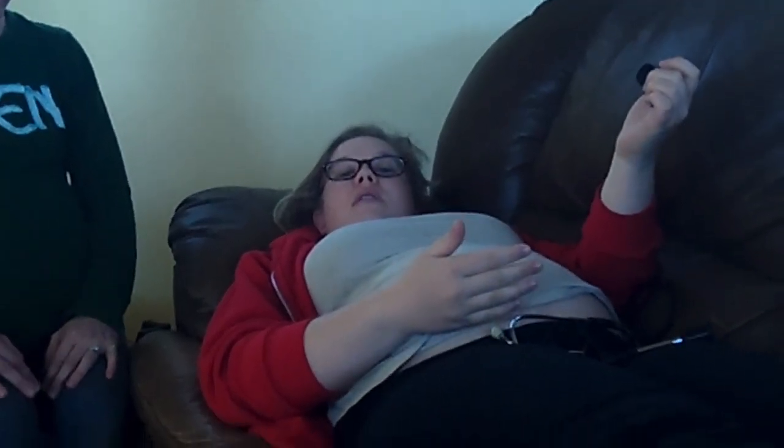So it's a glorious sound to find. You feel very proud of yourself when you do find it. Yep. And then Mary's going to talk more about what the heart rate sounds like later. But earlier, it's got less variability also. So the baby's nervous system and brain, all of it isn't responding to movement yet.